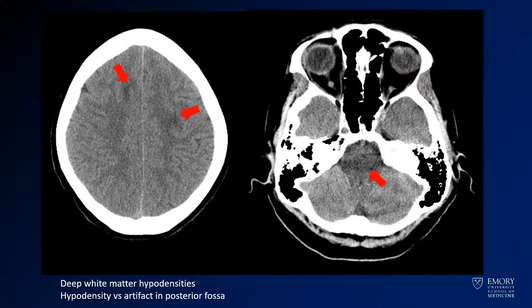Here you see the original CT. You have some hypodensities in the deep white matter, particularly up near the vertex. The abnormality on the right — this hypodensity in the brainstem — is very difficult to confirm as a real finding, given that this is an area prone to artifact from the adjacent bone.